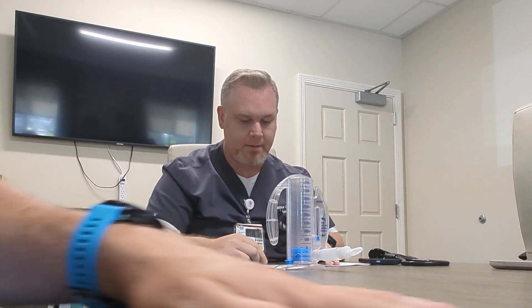Not everyone can do this exercise the same because we're all a little different. West is a larger person than Shane, so his targets will be different. Inside the incentive spirometer is a document that tells you what someone's target might be. Men and women have different goals because our thoraxes are different sizes and lung capacities differ. You look at height and weight to find an appropriate target. That target is called inspiratory capacity - basically all the volume you can move in and out of your lungs from the end of expiration to the peak of inspiration.